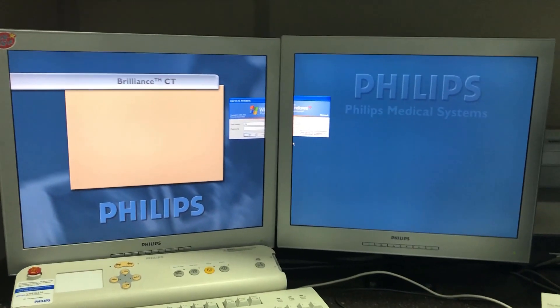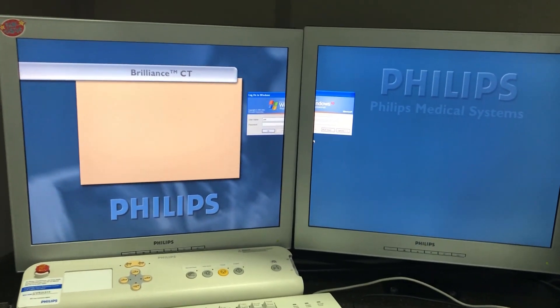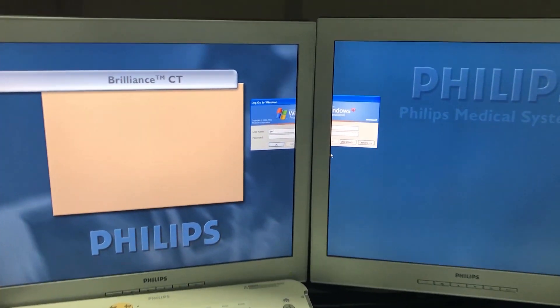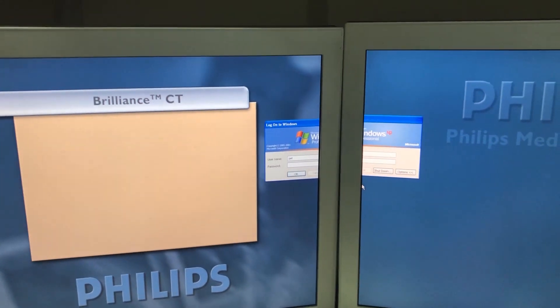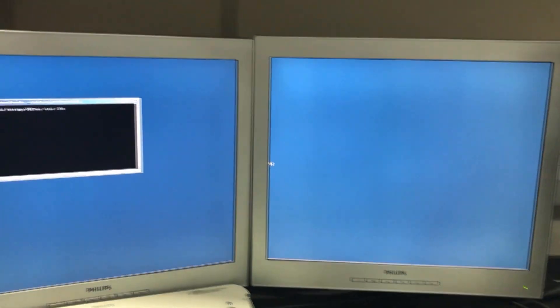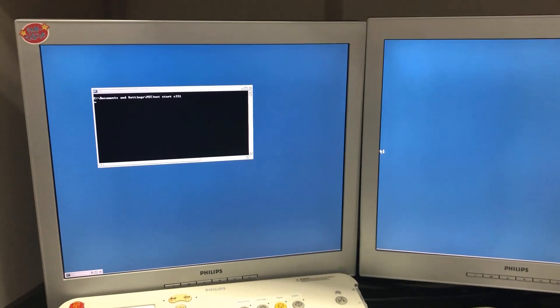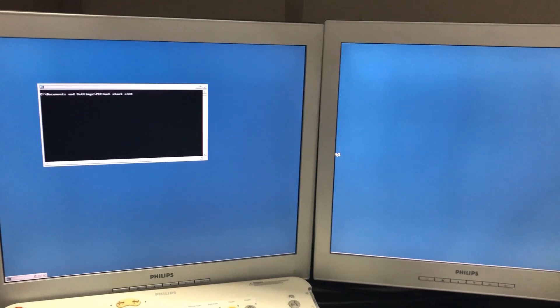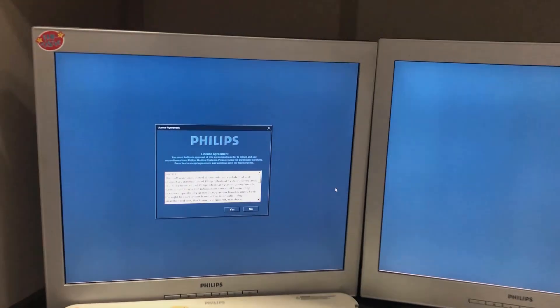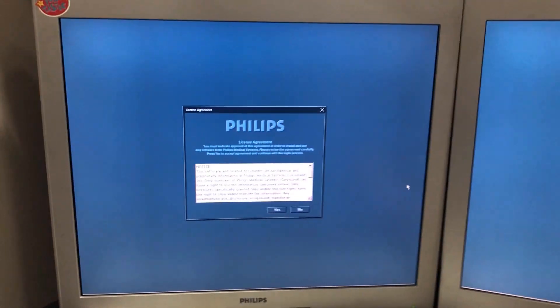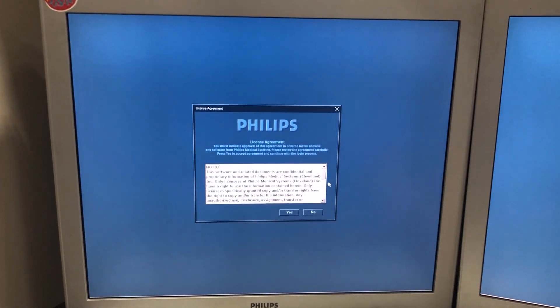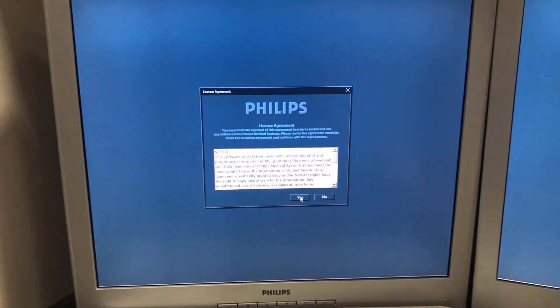Once the CT host is all the way to the login screen, we're just going to log in to the CT host. After just a couple minutes, it'll come up to this licensing agreement.